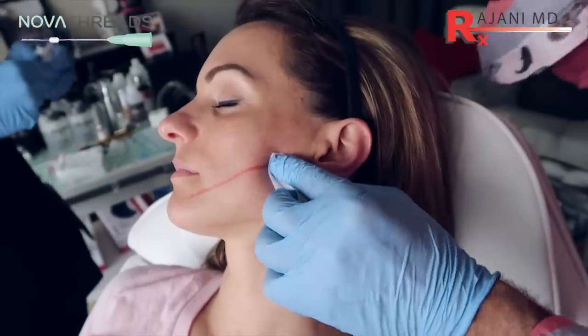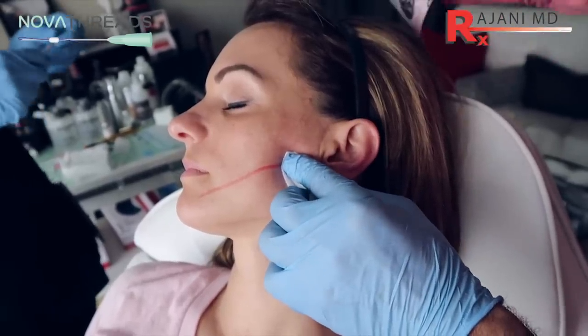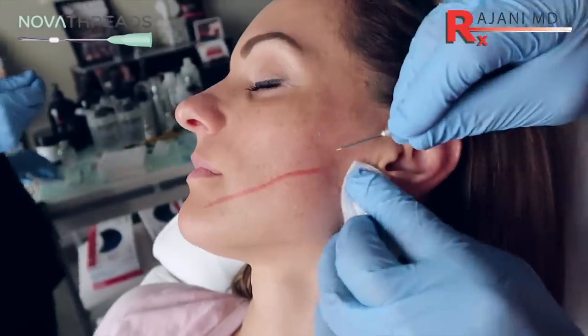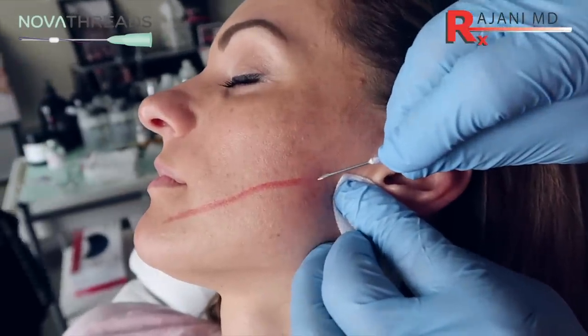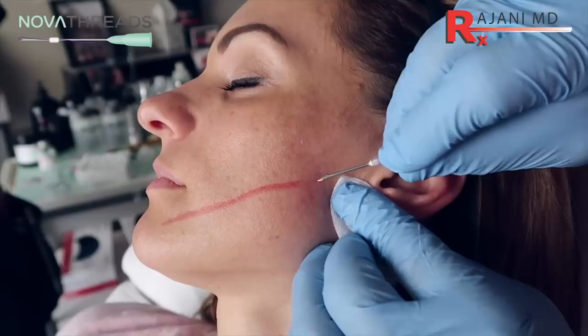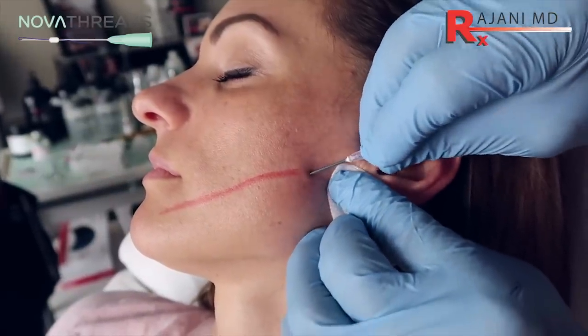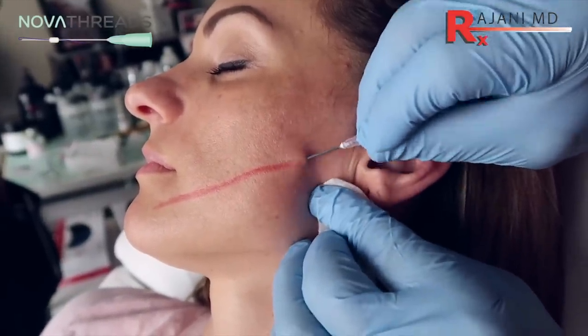I'll take that 18 gauge needle to create the opening. I make an opening with an 18, even if we're using a 23 — I like the 18. It gives a nicely sized opening and gives you the option of putting different threads through it. So a little poke here and then just stretching the skin.